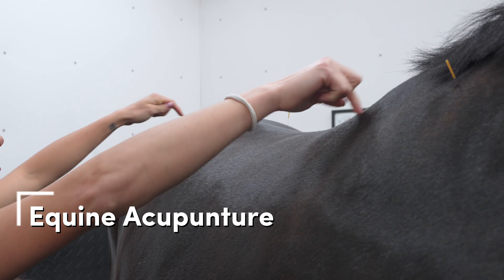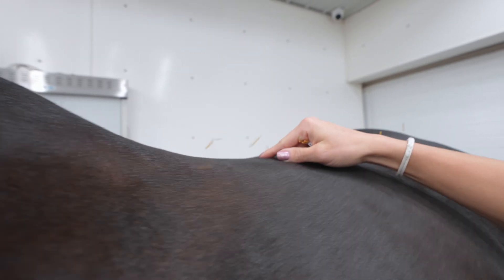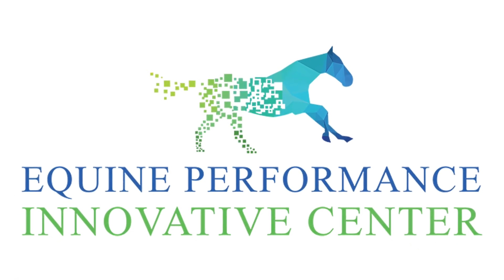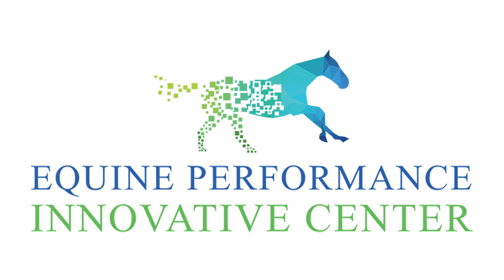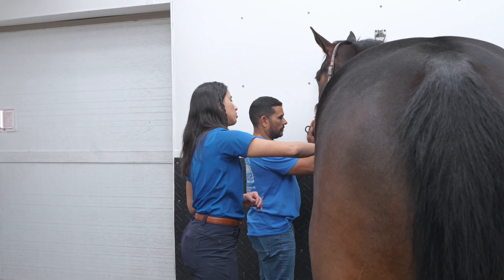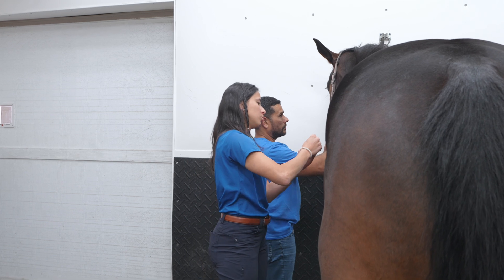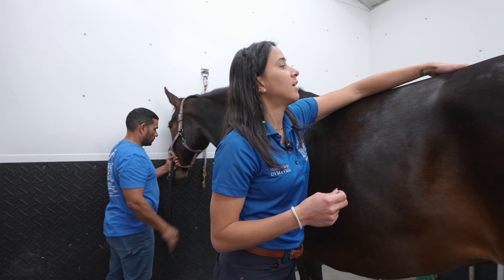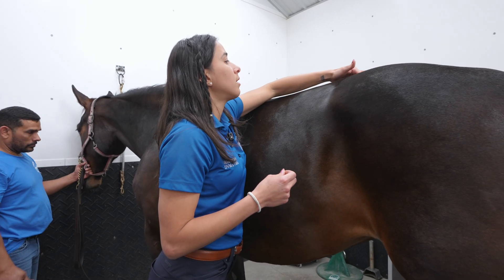The spine — one side of the muscles are relaxing. These needles help for calming and for stress. If your animal has a lot of anxiety, it will calm them down.